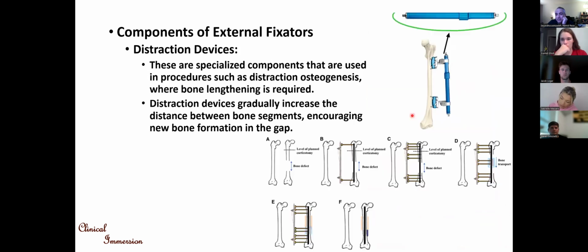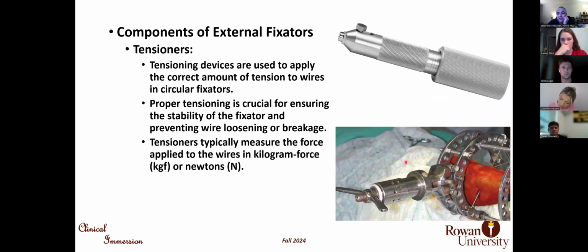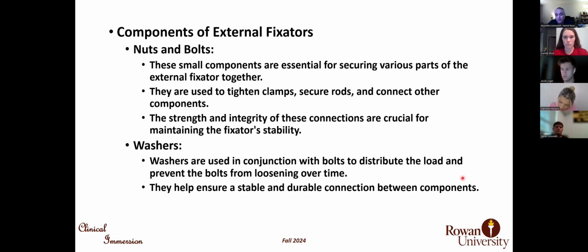How does it happen? It happens by this tension. When you insert this wire, you see they are very thin. You will see later in the video, we apply some tension to these wires and then we fix them. So the wire is under tension, like here's our wire. It is under tension. And that is why they can hold the load and you can apply weight on the ring.